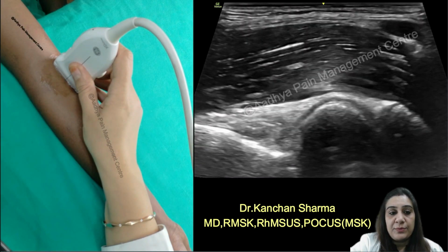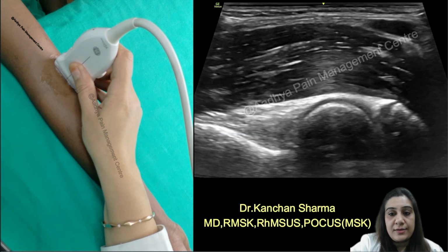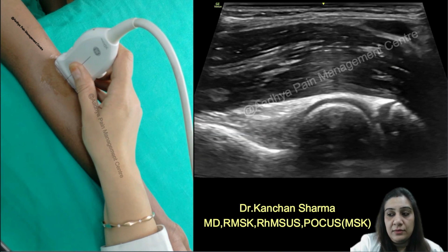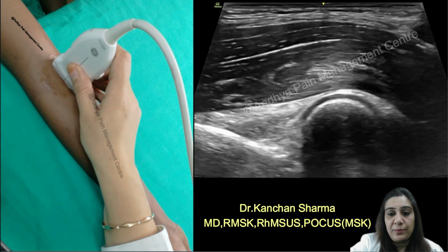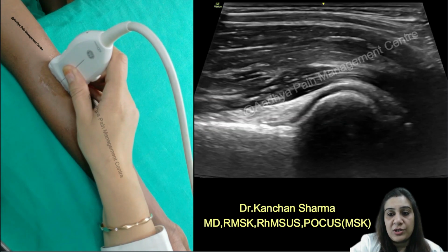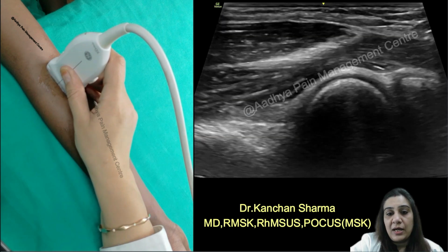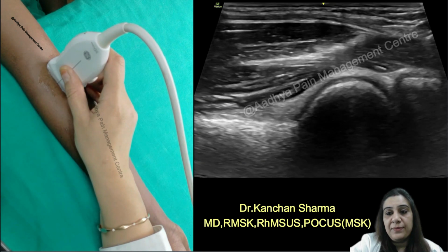So now I'm going to keep the same orientation. That is, I'm looking at the longitudinal axis of the brachialis muscle, and now I'm going to slide my probe towards the lateral side. Maintaining the same orientation, I'm just sliding my probe. And once I'm sliding my probe, I will be able to see something like this.